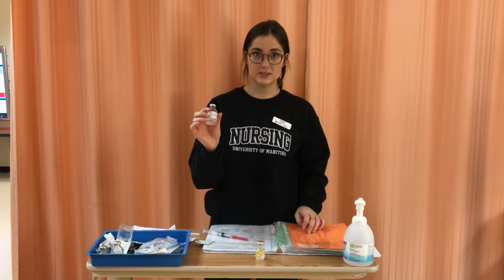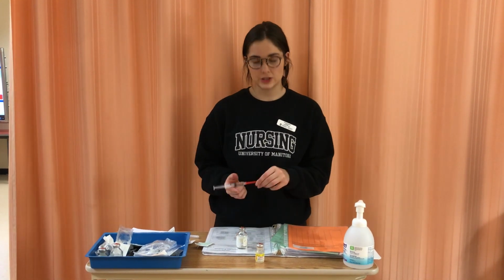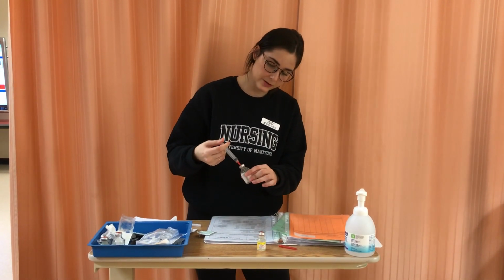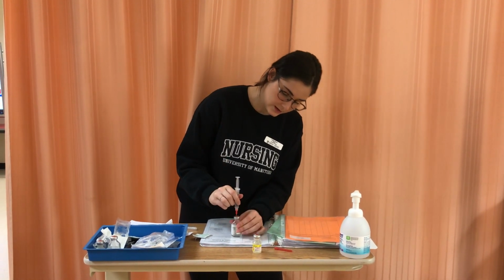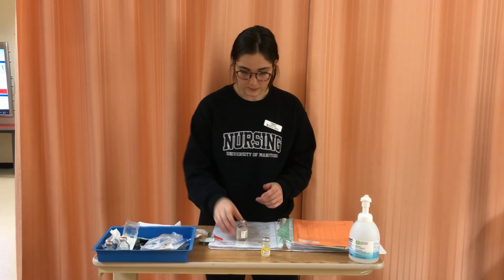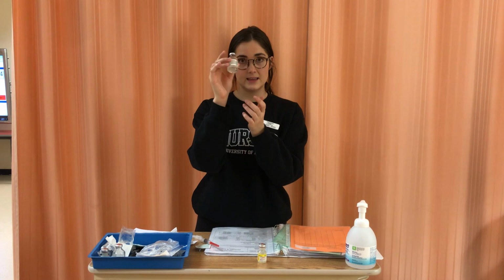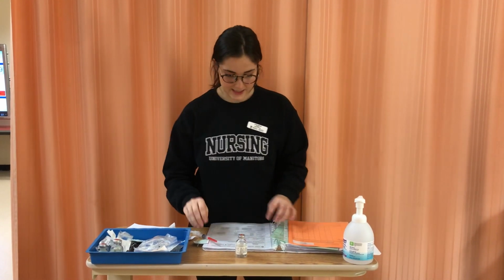And so now we're going to inject this into our medication vial. We already swabbed this, so I don't need to do it again. If I was worried about that, I would just re-swab it. So I'm going to inject the diluent, and then take out the air to equalize the pressure. So 3.1, I'm going to remove it and cap my needle again. And I'm just going to mix this around in my hands to ensure that the medication is fully diluted. So after I do this, I'm going to look at it and I see that there's no particles anymore, so I know it's diluted. And now we're going to take out our required amount.